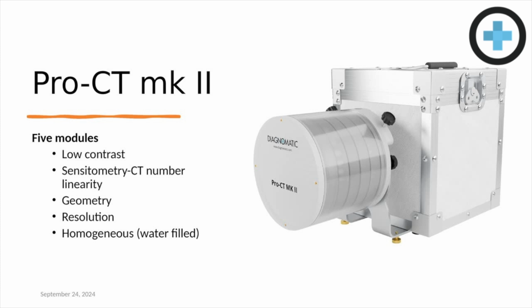So that moves on to the ProCT Mark II. Similar to the CatPhan, we have various modules. There are 5 inserts: the low contrast insert, a CT number linearity, geometry, resolution, and the homogeneity phantom, which is a water-filled phantom instead of a solid.